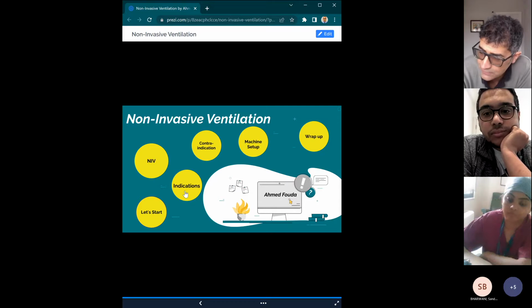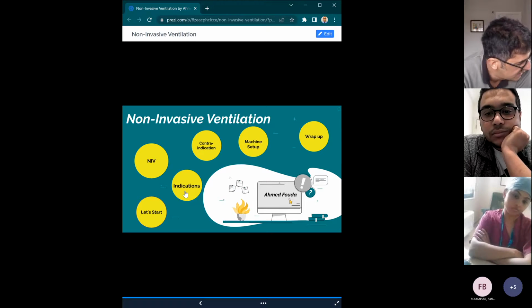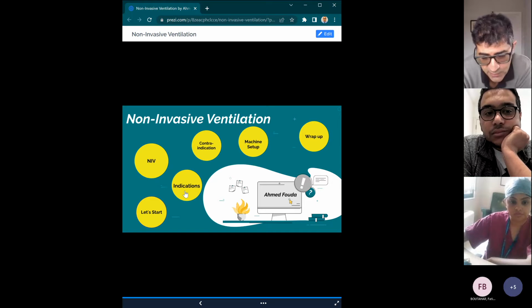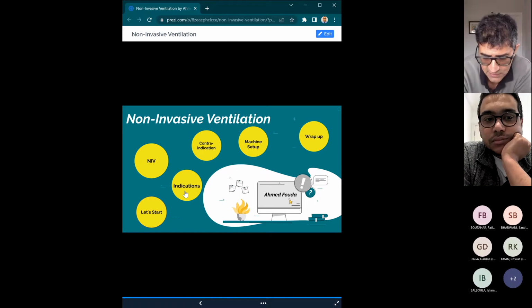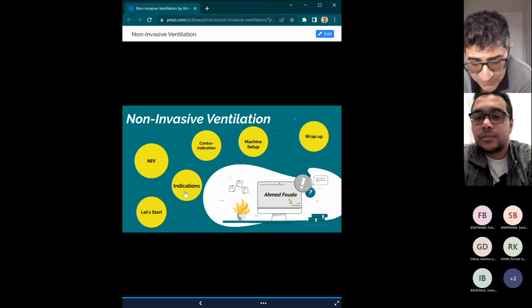Do you use it in asthma, NIV? And it can cause barotrauma, I guess, if you use it for a long time. Yeah, it can cause barotrauma. Certainly if they've got bullous disease, because it's positive pressure, you put more strain on the bulla, you can pop something, and for the same reason you can get pneumothorax. Okay, I was going to say give me some cardiovascular, but let's stick with the respiratory. Anything else?